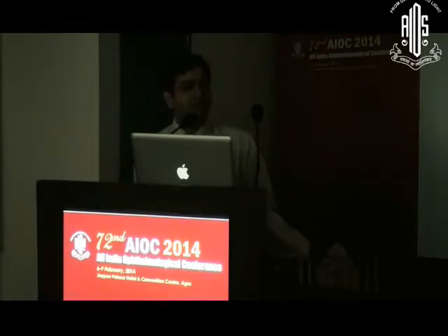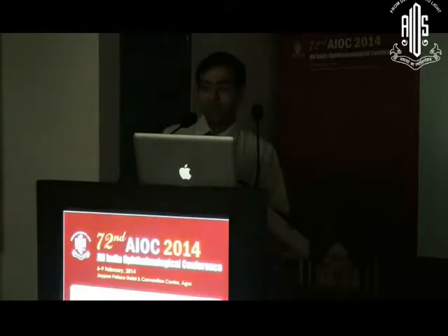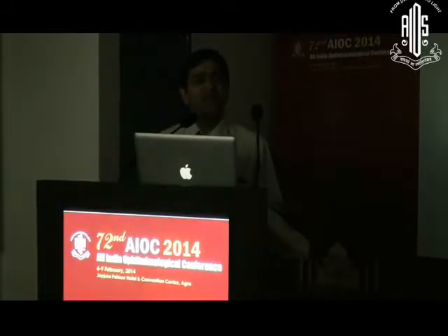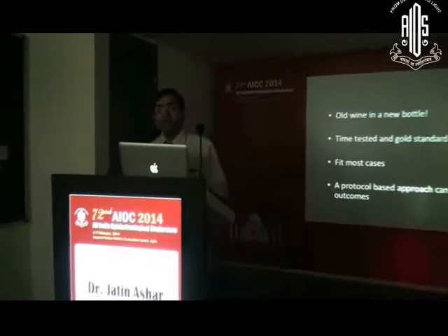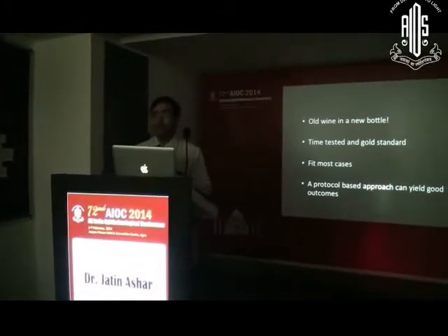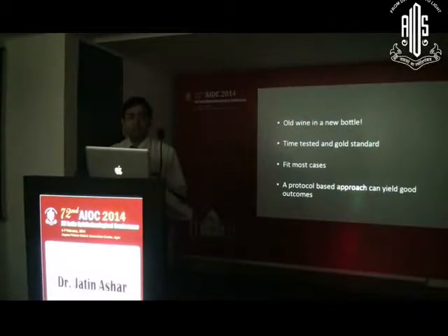With the available lenses today, there is a lot of variety of lenses that we have for keratoconus, and there is always a new lens coming into the market, and each one claims to be better than the other. However, these are all time tested and are actually the gold standard for improving not only the visual acuity but also the quality of vision in most of these patients with keratoconus. And in most cases, you get a good fit with most of these lenses.